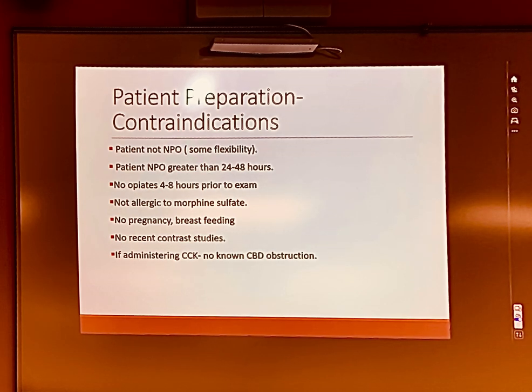Make sure that they're not pregnant or breastfeeding. And make sure they haven't had any recent contrast studies, though not for the reason that you think. Contrast is iodinated and it's very thick. Iodinated contrast is cleared through the kidneys and the bladder, but if they had oral contrast, it's cleared through the stomach and the intestines. And it will absorb your gamma rays and look like you have abnormalities on your study when you do not. So no recent contrast studies.